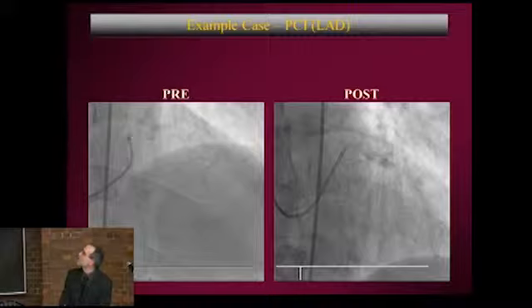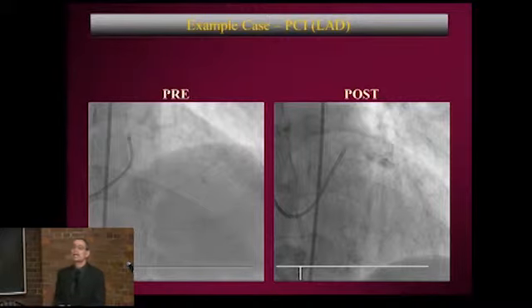And the amazing thing to me is you look at that and you say, well, there's nothing there, but they put in a wire, blew up a balloon, and suddenly you've got this beautiful large vessel again resupplying the anterior territory. So certainly the sooner you can get that open, revascularized, the better for this patient.